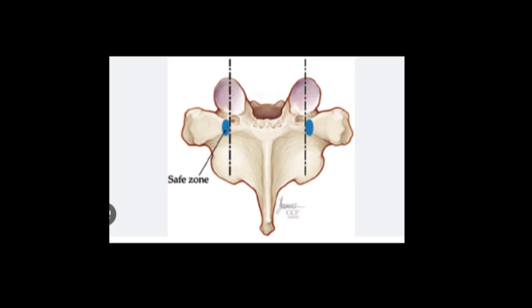So a midline, which is the midline of the superior articular facet, or a line which is bisecting the superior articular facet, can be a very important landmark. Why? Because most of the pedicle axis go lateral to this, and most of the ventral lamina are medial to this. So that can work as a safe zone for pedicle screw fixation in the thoracic spine.